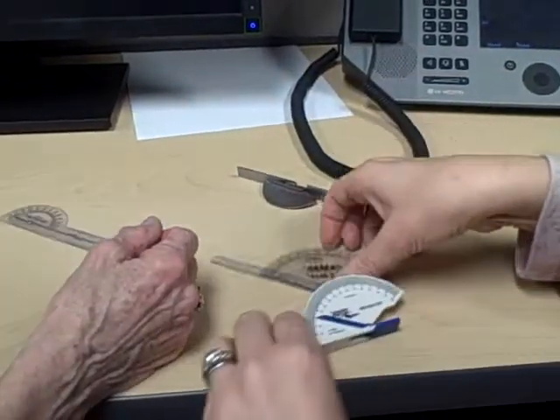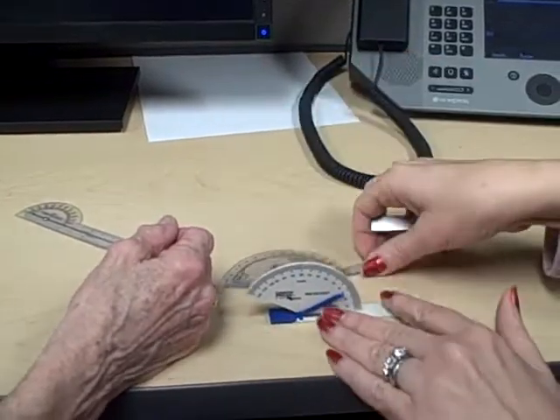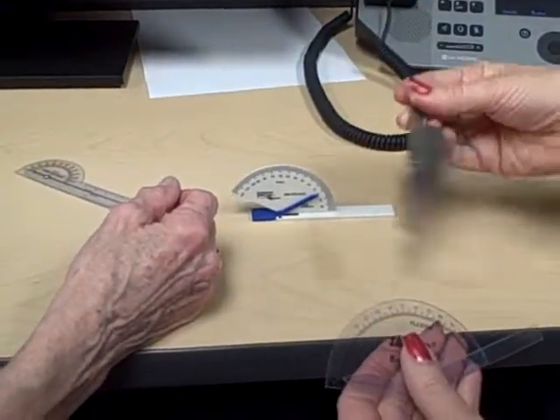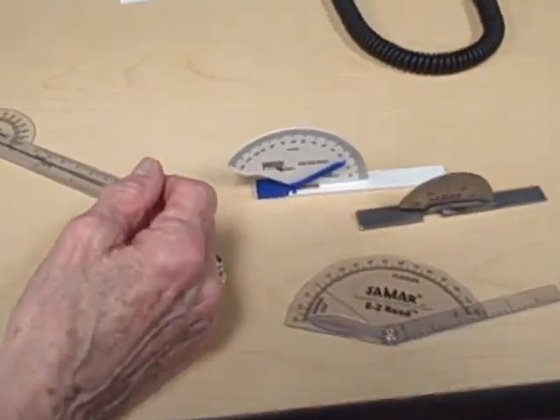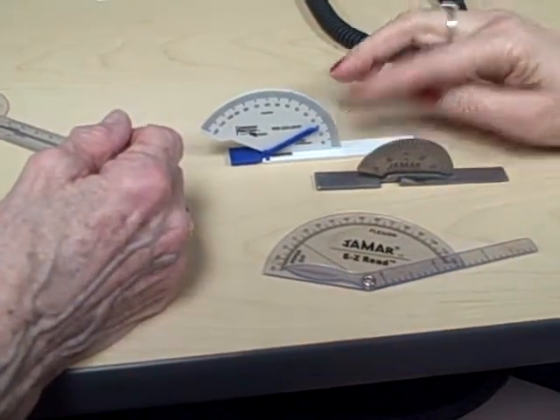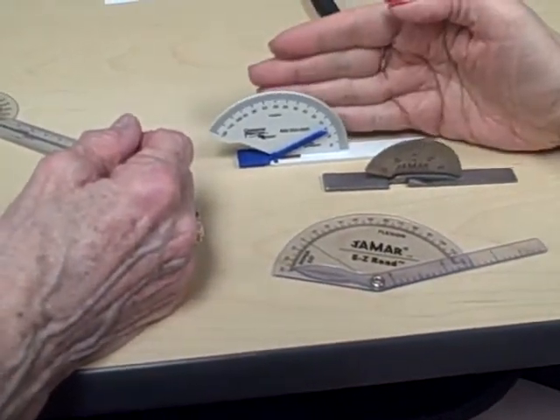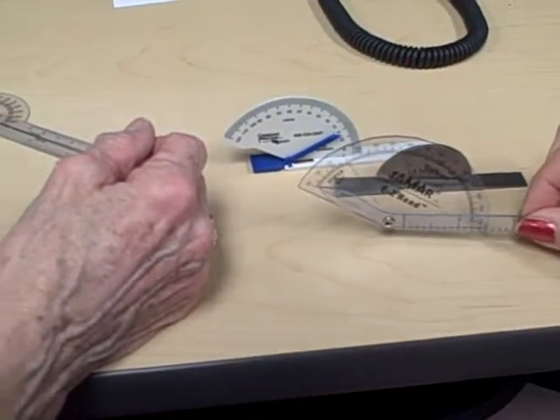Very often therapists will use one of these three finger goniometers. Look at the difference between these three — notice that on these two, the arm is perpendicular to the measuring scale, but on this one it's parallel to it.